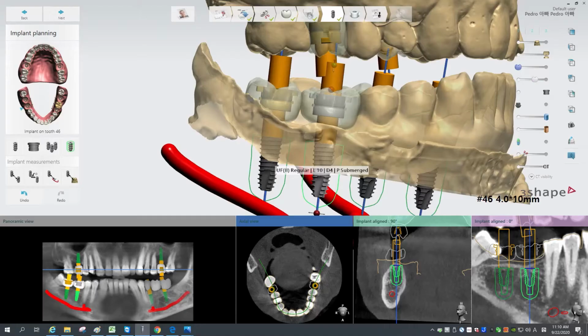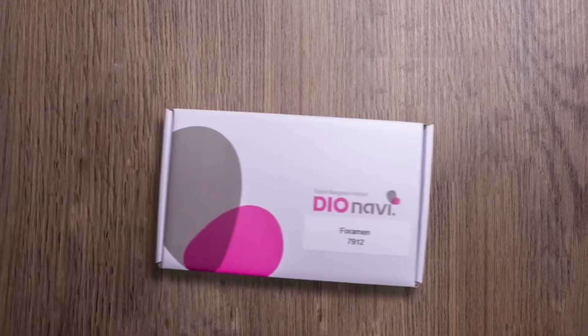Of course, the distortion caused by the impression procedure, the impression material contraction, the cast expansion, the bubbles on the surface, etc., is something to take into account. This is particularly true when dealing with periodontal patients or patients wearing braces. Impressions from these cases are much inferior to the results that an intraoral scanner can obtain. We then start a collaboration with DIO, where we suggest the implant placement, and then rectify, if needed, the proposed treatment by their team. Once we agree about everything, in a few days you will receive a box.